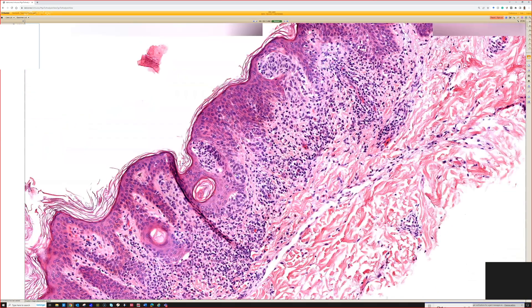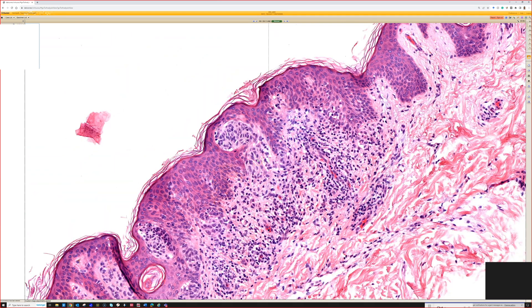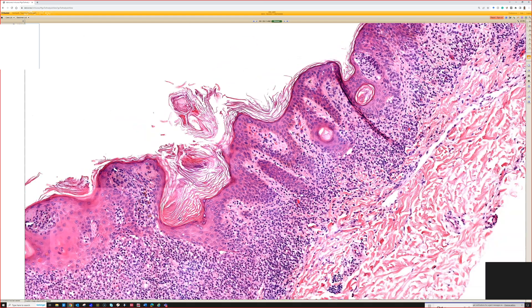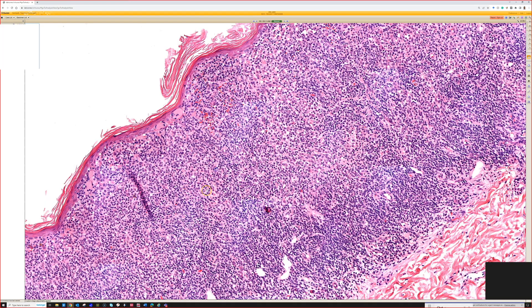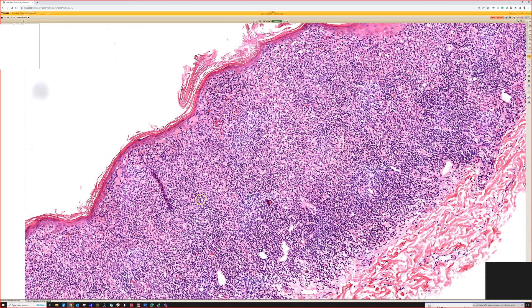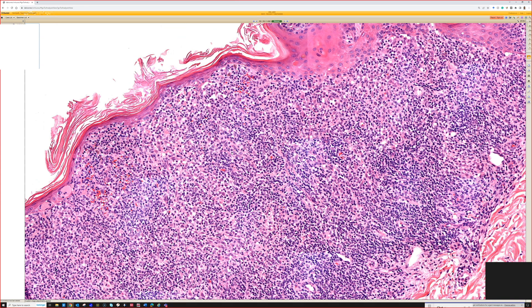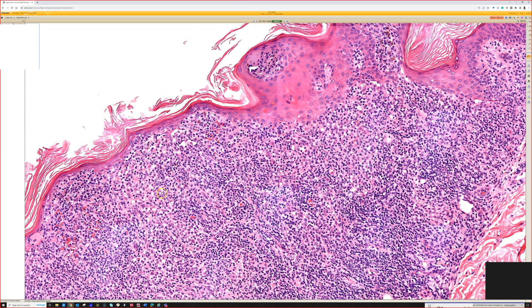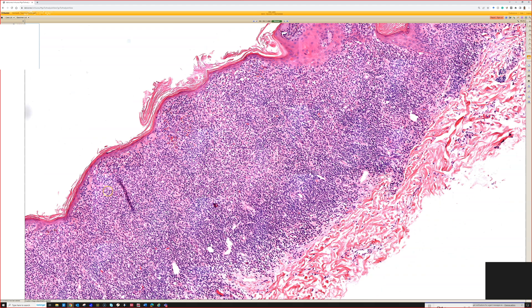There — you can see the nests. When you get a nevus that has a dense mix of lymphocytes, I would probably sign this out as a nevus with brisk inflammation. Based on the clinical presentation, nevi like this often have a halo of depigmentation around them — we call this halo nevus or halo nevus phenomenon. I sign it out as nevus with brisk inflammation, and if told there was a halo, I'd note the brisk inflammation corresponds to the halo phenomenon seen clinically.